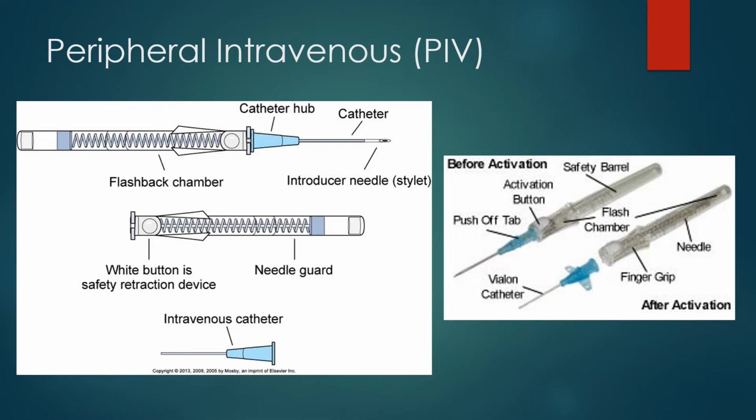So you're going to go into your patient's room that needs the IV. You're going to place that tourniquet on. You're going to look at those vessels and you're going to think, this is a really great spot to start this IV. Make sure you check the patient, look at their entire arm, look at their hands, and maybe the only ones you see are very small veins in those hands. Those little ones aren't going to be able to tolerate a really large size IV. So maybe you can see it well, you can feel it well, but it's a small one, so making sure you get the appropriate size IV.